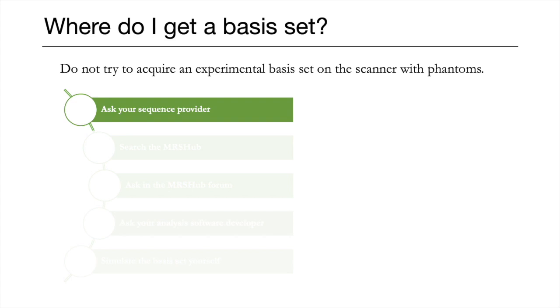Well, first, ask your sequence provider. They very likely use their sequences themselves, and they may have a basis set for you, unless you are using vendor stock sequences, because vendors usually don't provide basis sets themselves.